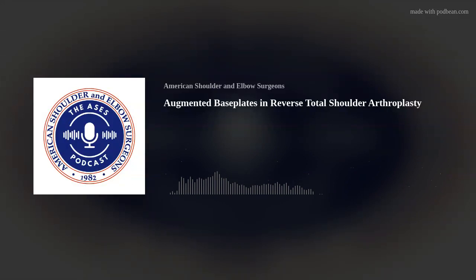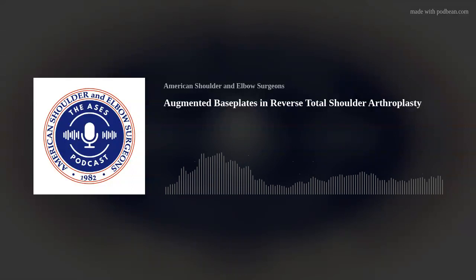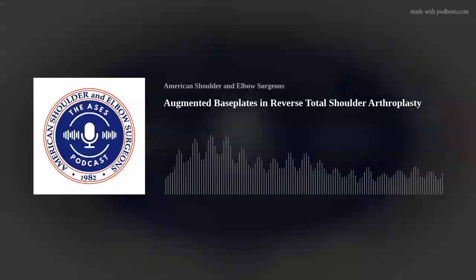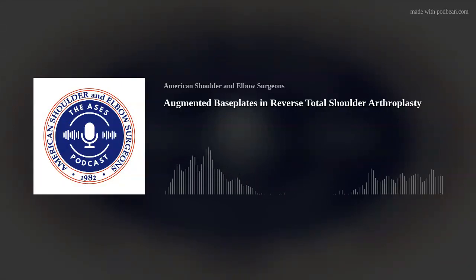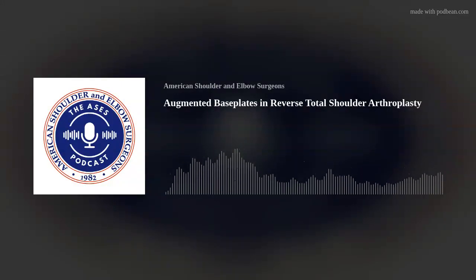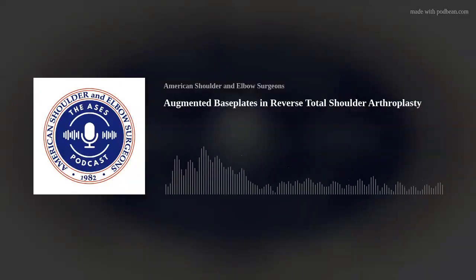Okay, what about you, Chris Klifto? Oh, Peter, we actually talked about this a lot, and I learned a lot of my technique from you. I use an augment almost every time for this patient, and the reason is not only do I want to correct the inclination, like Andy said, these like to, if they're going to dislocate, kind of dislocate lateral and superior. And the ones with the irreparable rotator cuffs, I get more concerned with for dislocations and rotator cuff arthropathy. So having an inclination built in with my wedge is the objective I'm trying to achieve. And not only that, the wedges also usually lateralize a little bit more. That gives me a little bit more stability for these patients, and that makes me a little bit more comfortable leaving the operating room.